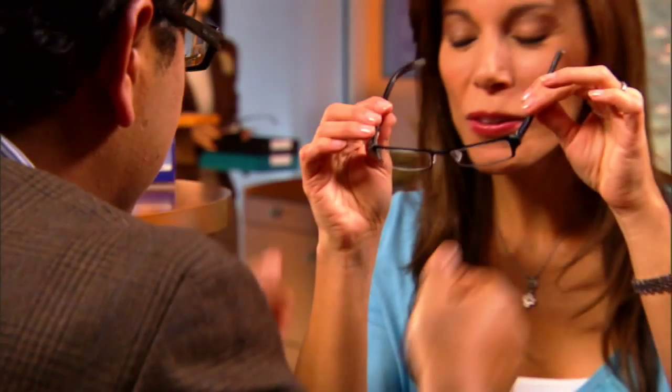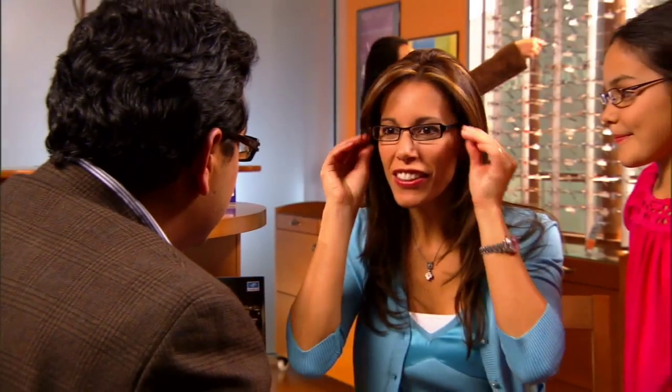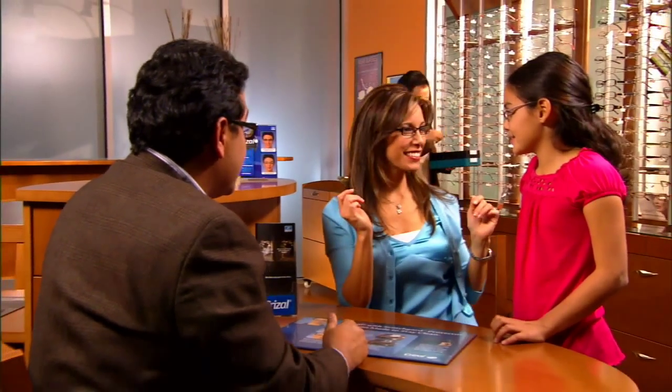For eye care professionals it means your patients can enjoy incredibly clear vision every day. And new and improved Crizal Alize is the perfect upgrade for patients who already wear basic Crizal or competitive lenses.